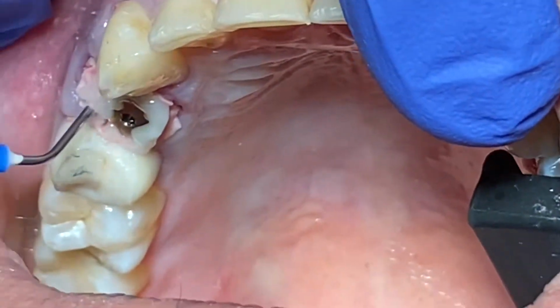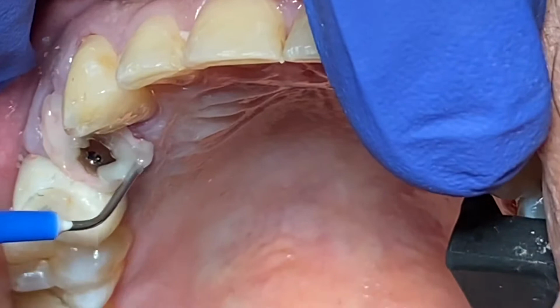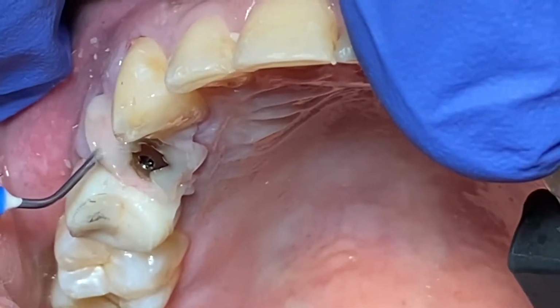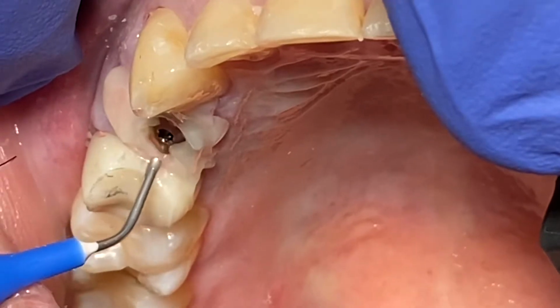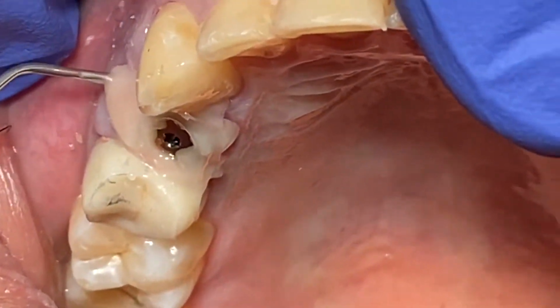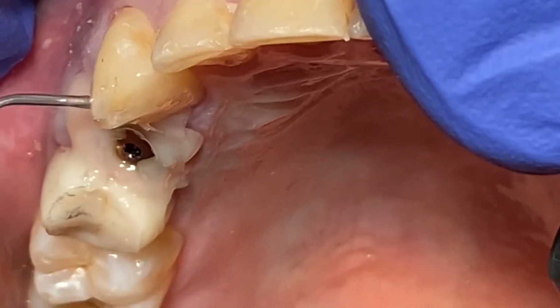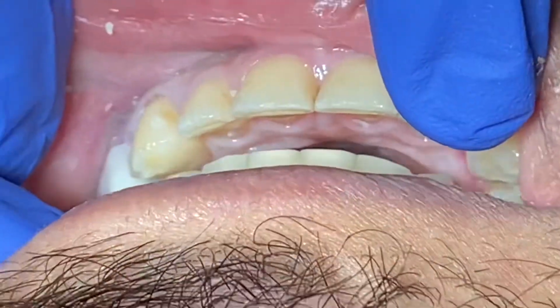So that's what I'm doing right now, putting flowable on top of those membrane areas and including the surrounding adjacent teeth as well, just to create some retention for the membrane. I told the patient I'm trying to have it at least 2 to 3 weeks, and if it comes out, by that time this area of soft tissue should be converted into young soft tissue gum. So this is something that helps to preserve the facial aspect for the aesthetic area. Also, it helps maintain the bone particulate material that I put in.